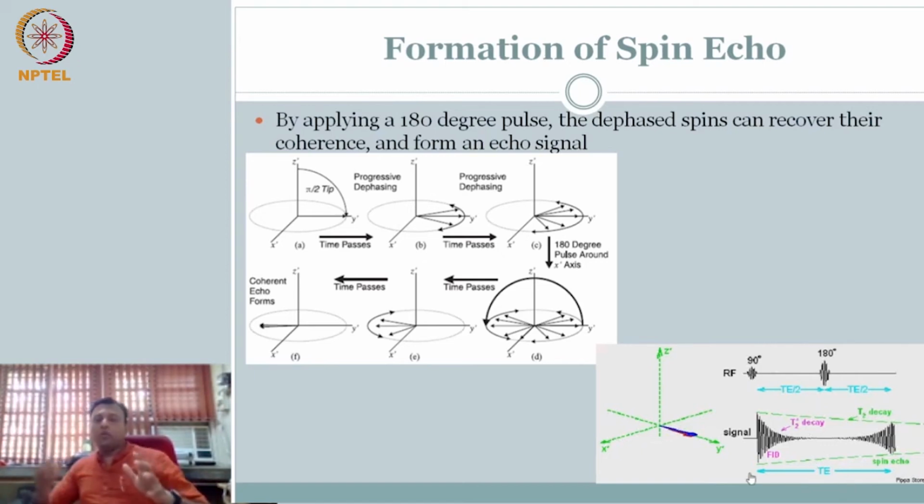So essentially you notice there is inherent contrast, inherent signal due to material property based on T2 relaxation time, T1 relaxation time, and the proton density. How many protons are there in that volume, right? That is a material property. So that signal I can manipulate, which aspect I want to see of that sample volume of that tissue. Do I want to see the T2 characteristics? Sure. Do I want to see the T1 characteristic of the tissue, or am I just happy with how many protons are there in that given volume?